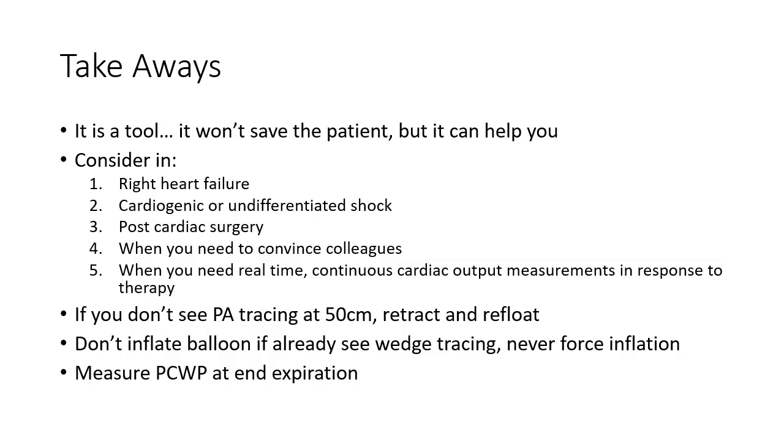And then finally, measure pulmonary capillary wedge pressure at end expiration. That's when pressures are relatively equal between a spontaneously breathing patient and a mechanically ventilated patient.